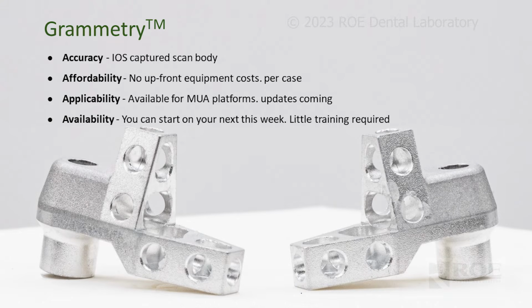Well, our contention is that grammetry does a lot of the same, right? Because you are taking what you see here, which is a grammetry scan body. You're screwing it directly to the multi-unit abutment. You're luting it passively in the mouth, and then you are scanning it with an iOS for a resin prosthesis, which has worked brilliantly. And then you either put it in your lab scanner or you ship it to the lab, and then this is a scan body. All right, so it's direct.